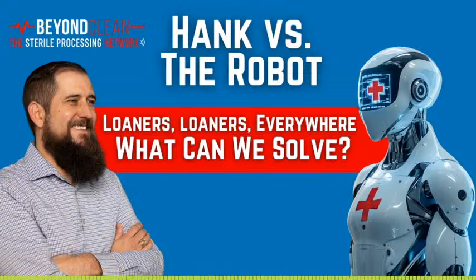Three, compliance with standards. Agencies like AAMI and DNV emphasize that instruments must be delivered in a condition that allows for proper sterilization. When trays arrive late or incomplete, SPDs are left scrambling to meet these compliance standards. Here's the kicker. When vendors fail to meet this delivery standard, it's not just a vendor problem, it becomes a patient safety risk. SPD teams are forced into reactive mode, rushing processes, which increases the chance of assembly errors or skipped steps in reprocessing. That's why this isn't just a logistical issue, it's a quality and safety issue.